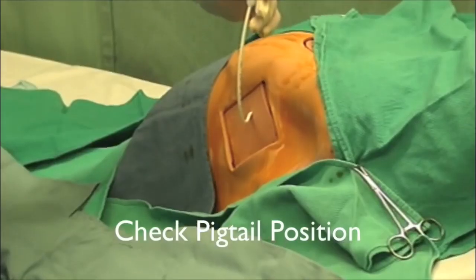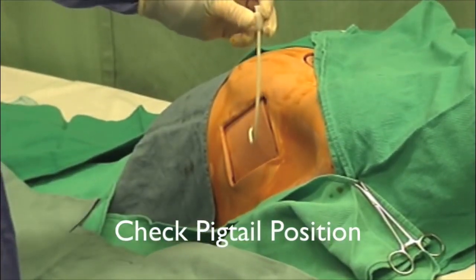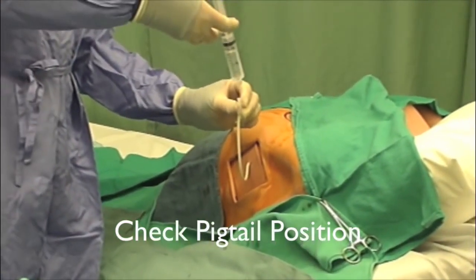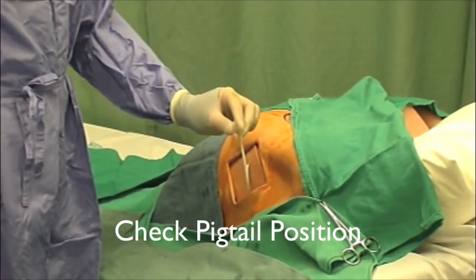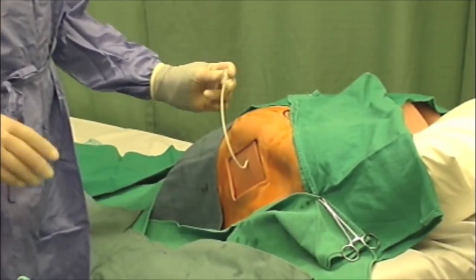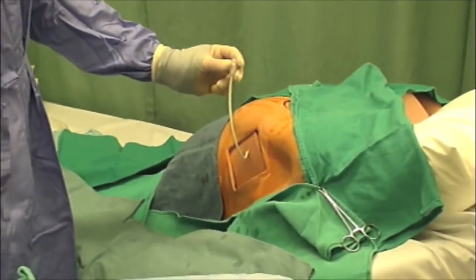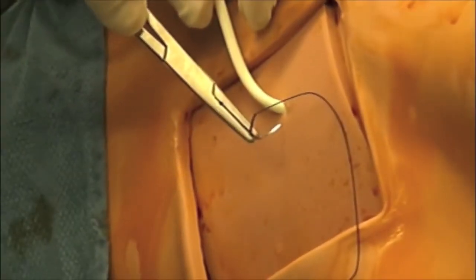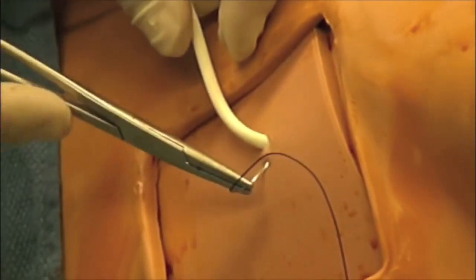The rest of the procedure is identical to before. Place a few drops of normal saline or lidocaine in the catheter opening. If the catheter is in the pleural space, the fluid will flow down the catheter. Ask the patient to cough and the fluid will be expelled. Suture the catheter to the skin.